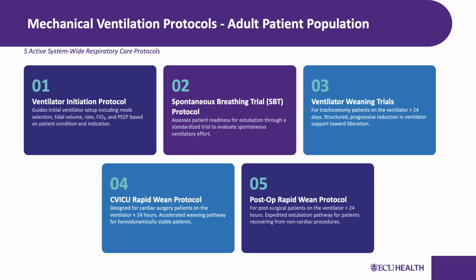Okay, team, here's our bird's eye view. Right now, ECU Health has 5 active mechanical ventilation per respiratory care protocols that apply system-wide to our adult patient population. I want to walk you through each one briefly so you can have a full picture before we start diving deep into the algorithms. Look at this slide, follow along with me.